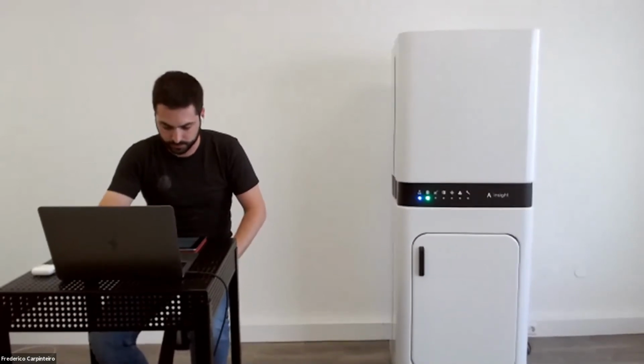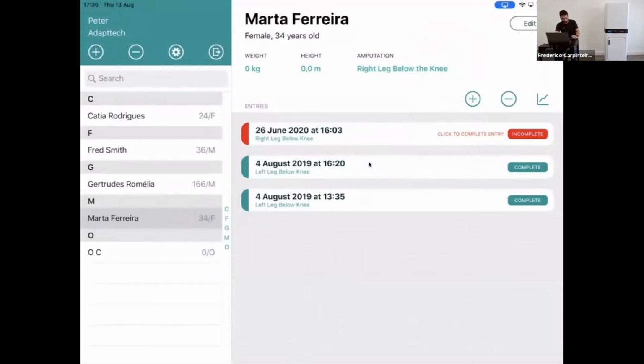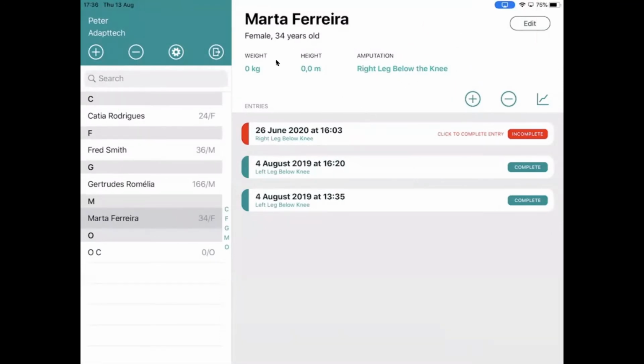Okay, let's share the iPad screen. So I think you all can see the screen right now, and you should also be able to see my video as well. Yeah, we've got it, Fred.